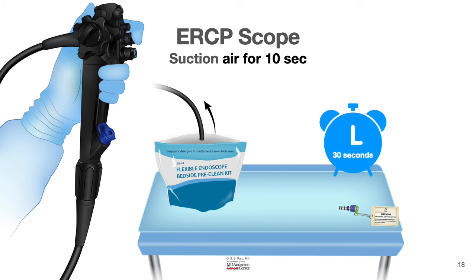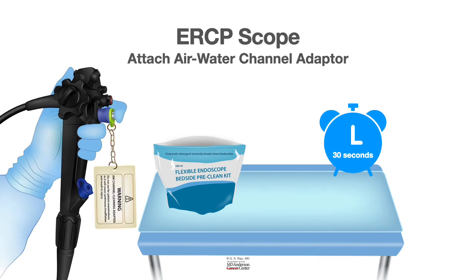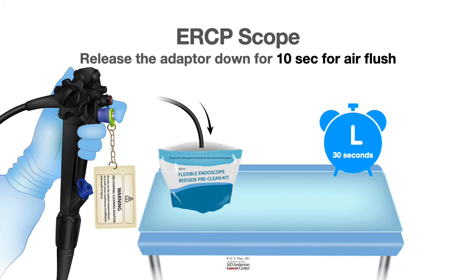Next, we go to the air-water channel cleaning. And as part of this, you remove the air-water button and replace it with the air-water adapter. Air-water channel adapter now is attached, and you press it down so that you flush water from the air-water channel for 30 seconds. So important to flush it for 30 seconds. And then you remove the finger press on the air-water adapter channel so that you flush air for 10 seconds. So 30 seconds of water, 10 seconds of air.